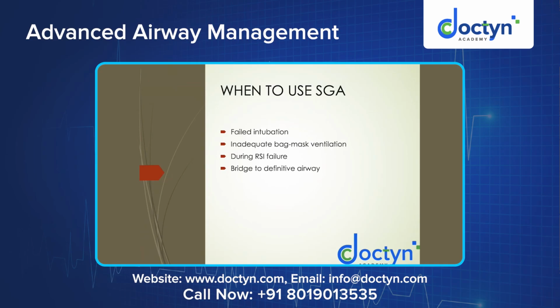Second thing, if there is inadequate bag mask ventilation. As we have discussed prior, this can happen if there is an obese patient, or you don't have a proper sized mask, or you don't have a second helper but the jaw is heavy and you need two hands to establish a proper seal, or everything is there but for whatever reason the bag mask ventilation is becoming inadequate. Then you pick up a supraglottic airway device, put it across the oral cavity, and it will establish a secure airway and a pathway to provide ventilation to the patient. So any time the intubation has failed, the supraglottic airway comes to the rescue. It is a bridge to the definitive airway.